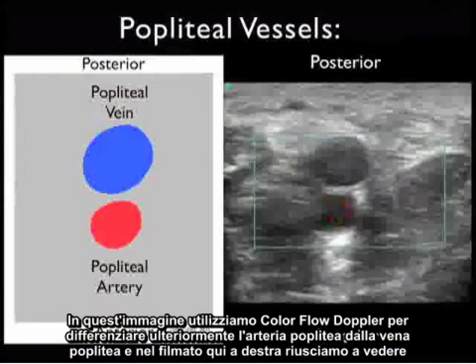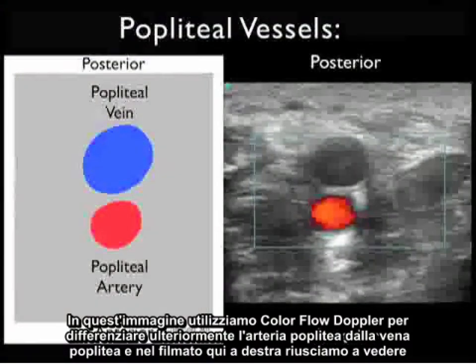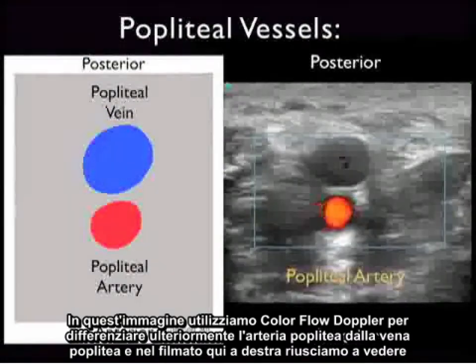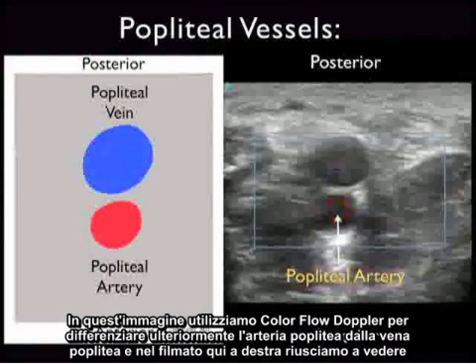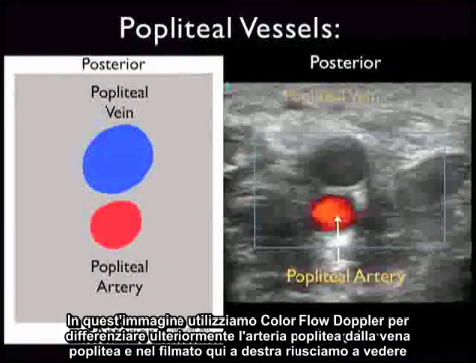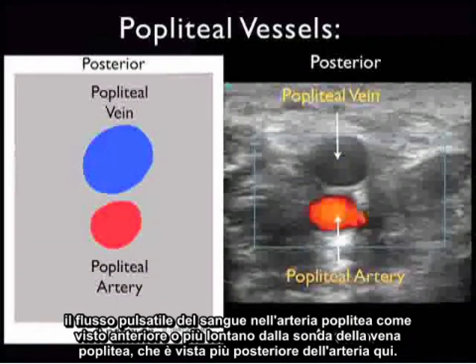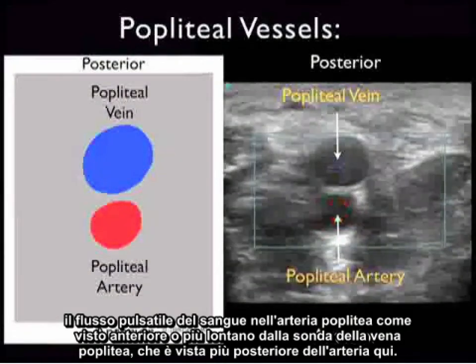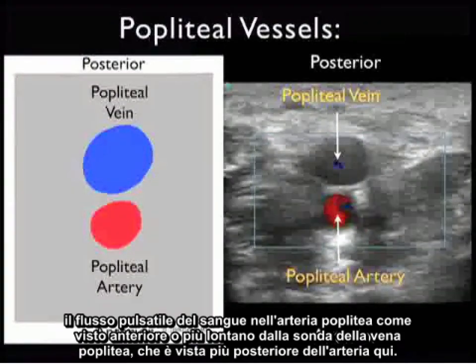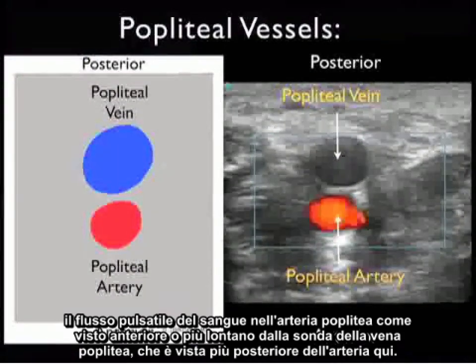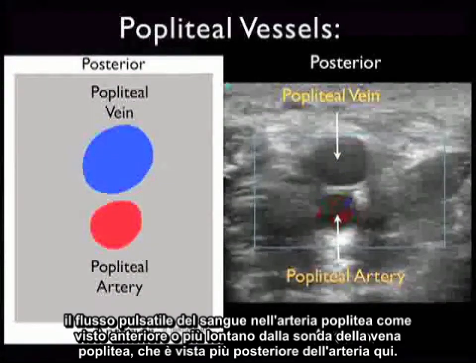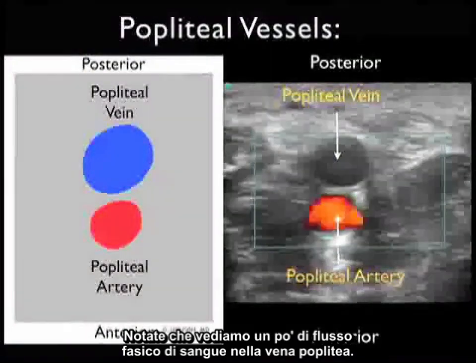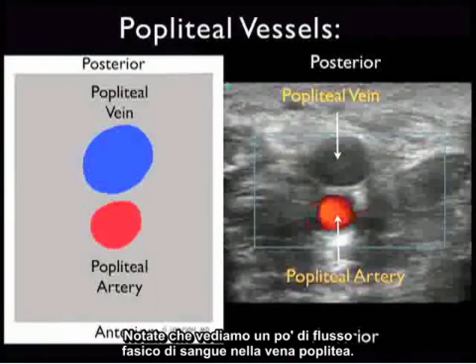In this image we'll use color flow Doppler to further differentiate the popliteal artery from the popliteal vein. In the video clip to the right, we can see the pulsatile flow of blood within the popliteal artery, seen anterior or further away from the probe than the popliteal vein, which is seen more posterior than the artery. Notice that we see a little bit of phasic flow of blood within the popliteal vein.